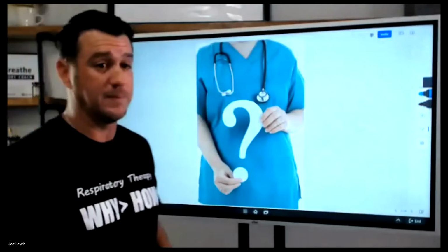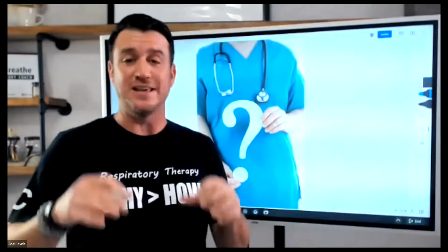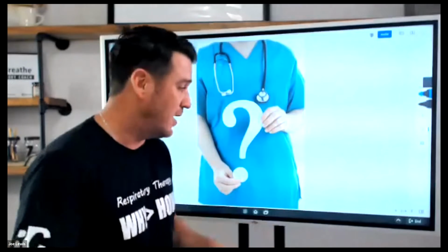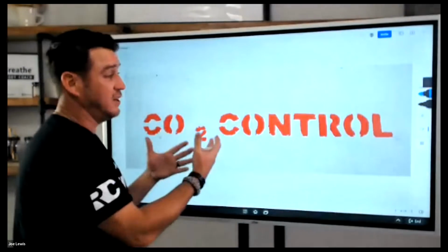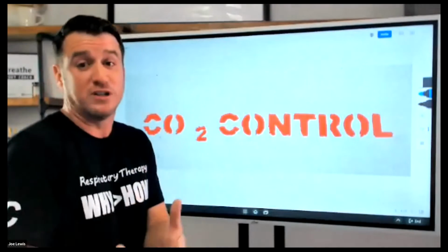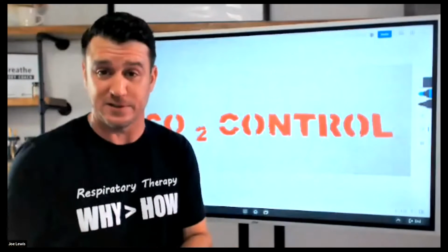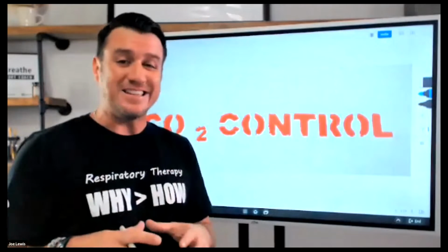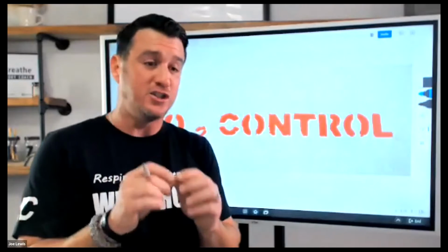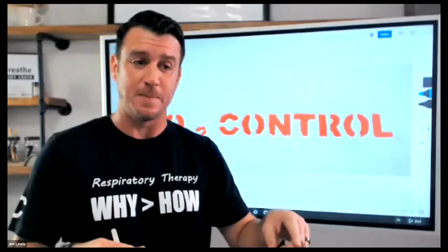So question number 1 is, and I'm going to talk in first person here, am I adequately ventilating my patient? Now, when we say ventilating, we understand that we're talking about the removal of CO2. This is CO2 control, or the elimination of carbon dioxide. We know that as respiratory therapists. Now, remember, I told you there's hazards with mechanical ventilation. So by asking yourself this question, you should address 2 of the common hazards that happen. One hazard being hypoventilation, the other one being hyperventilation.